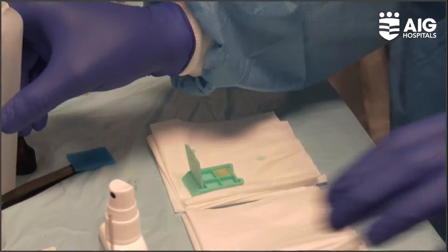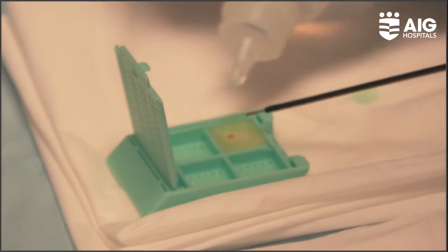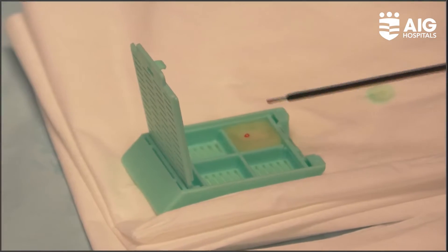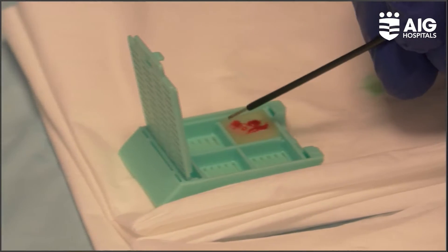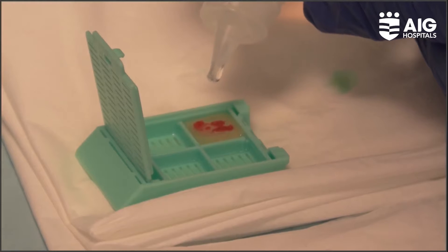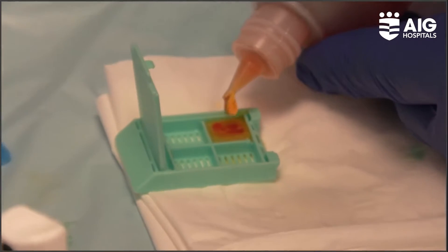The tray is ready and the tissue is now coming out. We have a pancreatic body mass which is also invading almost to the splenic hilum. We are seeing collaterals, the adrenal gland is enlarged, and there are varices — that's the cause of his pain. They are using a forcep to expel the tissue out. Once this is analyzed, the same tissue can then be put in a formalin bottle and sent for grossing and sectioning. The tissue does not get damaged — that's the beauty of this. You are not destroying anything, and it confirms you have adequate material which the pathologist can subsequently interpret.